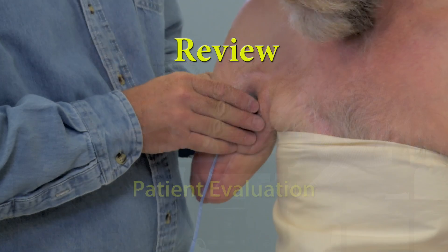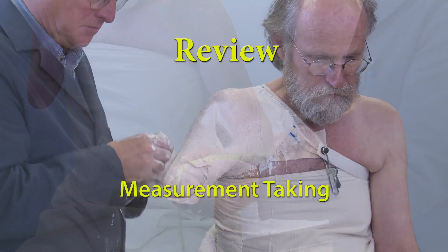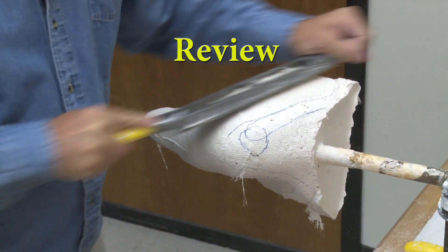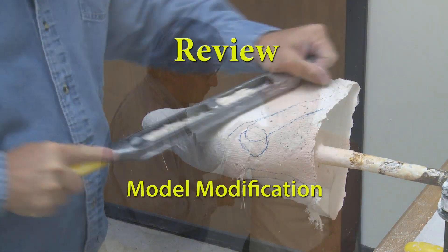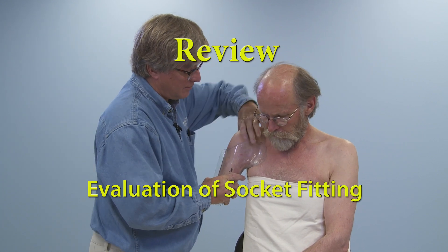Throughout this presentation, you have learned patient evaluation, EMG testing and evaluation, measurement taking, molding procedures, positive model modification, and evaluation of socket fitting for patients with a transhumeral amputation.